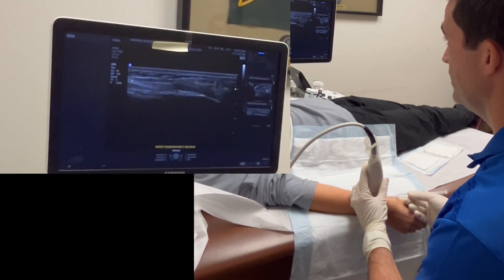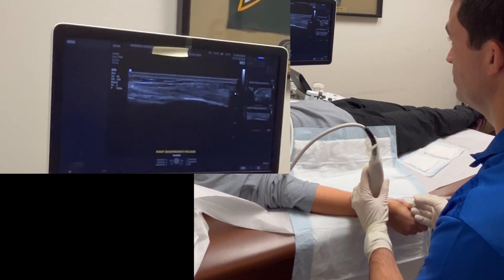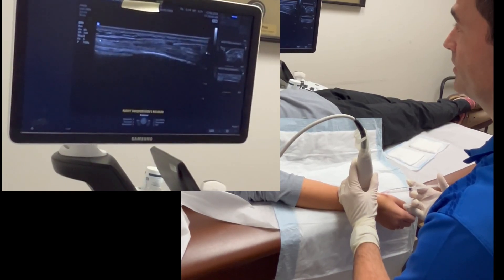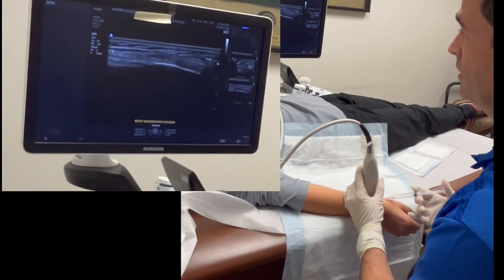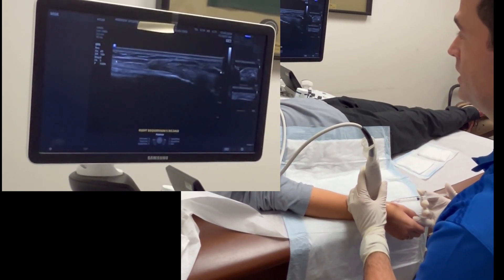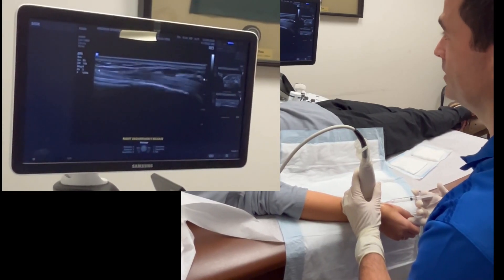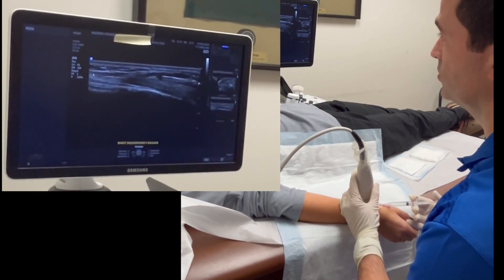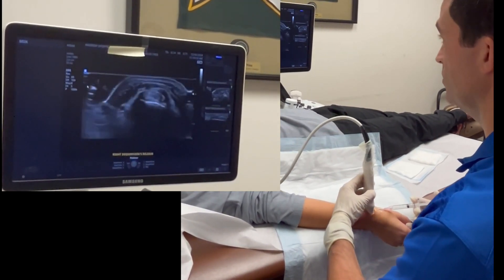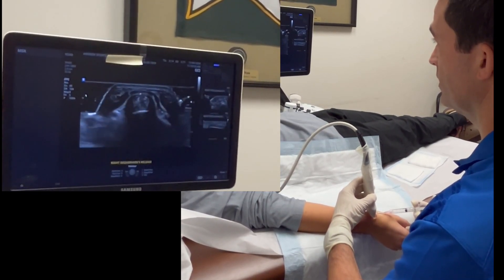There you saw how it gave — that shows where I've completed the incision through the extensor retinaculum. Once you see the scalpel make the full incision, we use the same needle to irrigate the area, injecting into the tendon sheath. I can see the retinaculum has now separated from the tendon and there is now space for fluid to travel through. Looking at it in long axis as well as short axis with the ultrasound, I can see the needle tip in the middle and the two separated edges of the retinaculum.